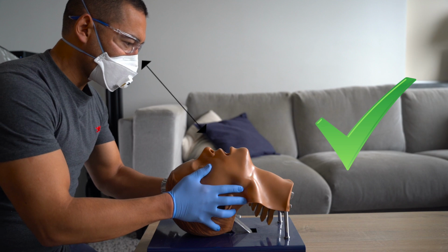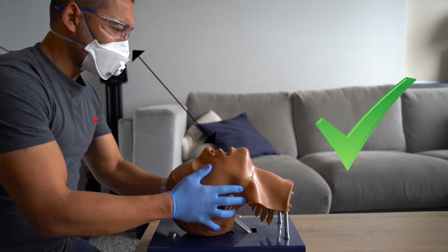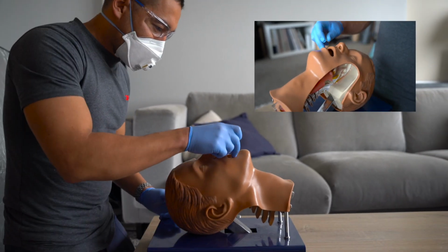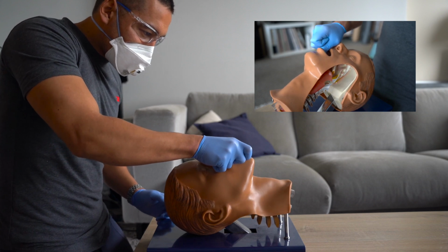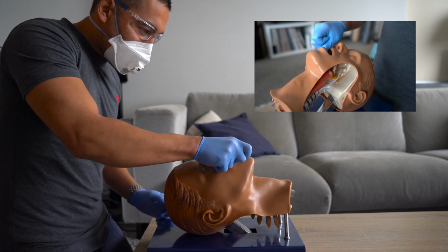Remember, you're trying to create a direct line of sight from your eyes to their glottis. With effective positioning of yourself and the patient, only a small amount of tissue displacement with the laryngoscope will be needed to bring the cords into view. Next, it's time to open the mouth with your right hand by placing your thumb on the lower jaw and your middle finger on the upper jaw. Pulling towards you also maintains the head in a position of extension.